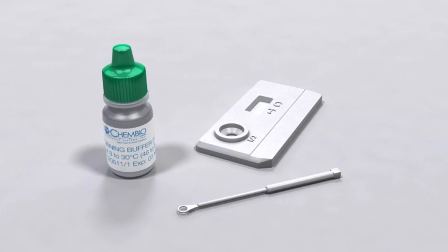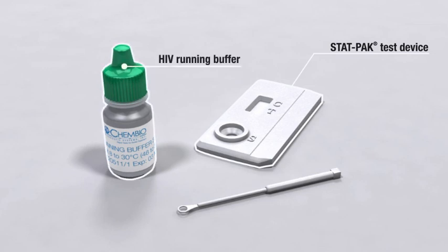The STATPAC HIV-1 and 2 test consists of the following components: the STATPAC HIV-1 and 2 test device, HIV running buffer bottle, green cap, and a disposable 5 microliter sampling loop.